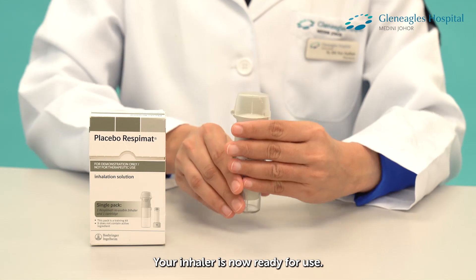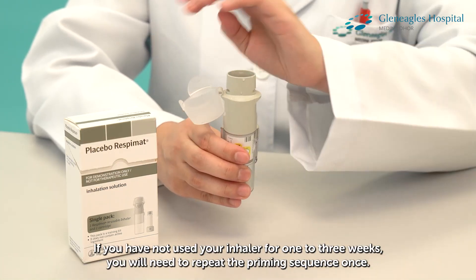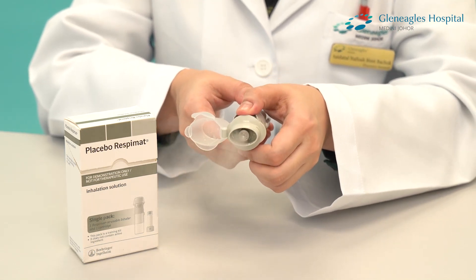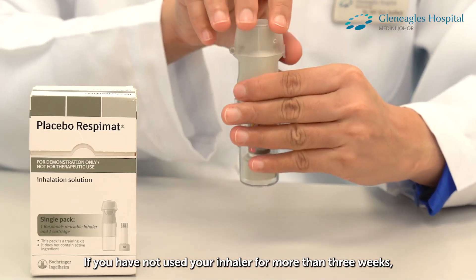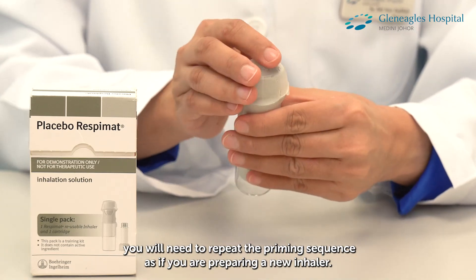The inhaler is now ready for use. If you have not used your inhaler for 1 to 3 weeks, you will need to repeat the priming sequence once. If you have not used your inhaler for more than 3 weeks, you will need to repeat the priming sequence as if you are preparing a new inhaler.